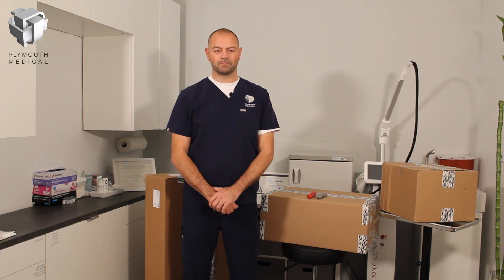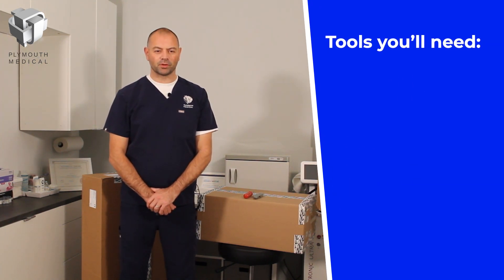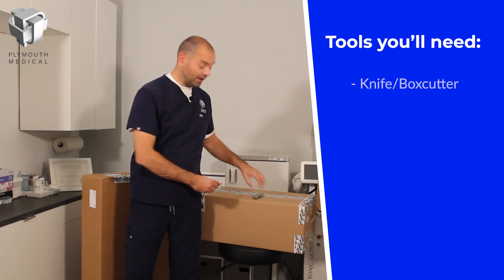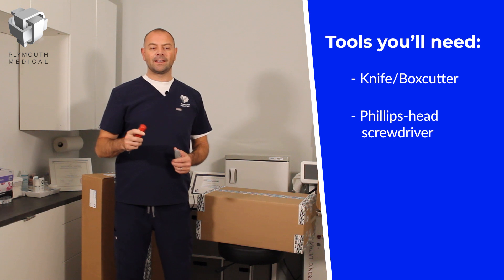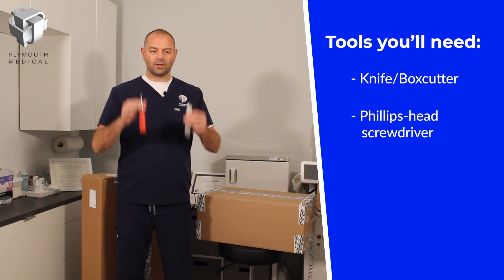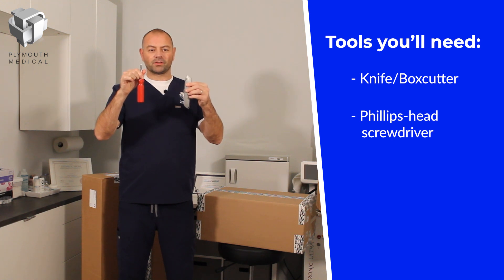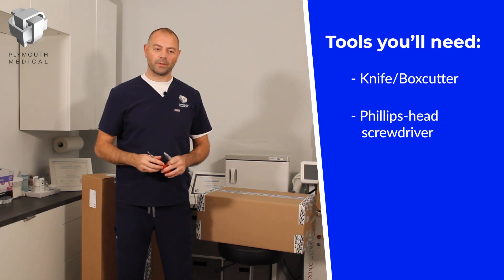Hi there, I'm Andrew with Plymouth Medical and today I'm going to be taking you through an unboxing and assembly of the Nitrinox Plus Nitrous Oxide and Oxygen Analgesia System. Before we begin, there are a couple of tools you'll need: a knife or box cutter, and a Phillips head screwdriver. The kit contains a wrench and a hex key, but no Phillips head screwdriver or box cutter, so make sure you have those before we begin.